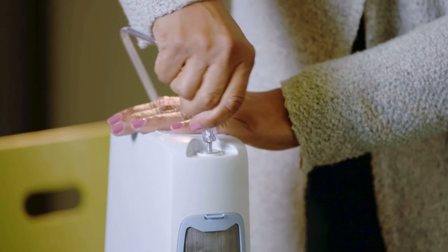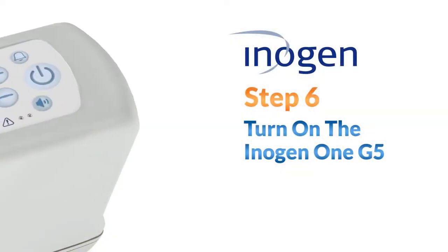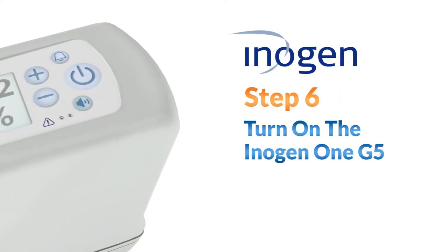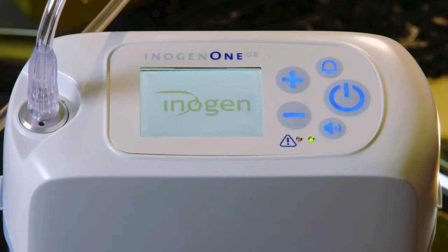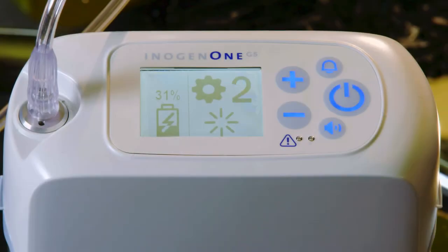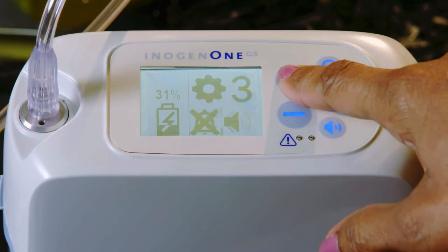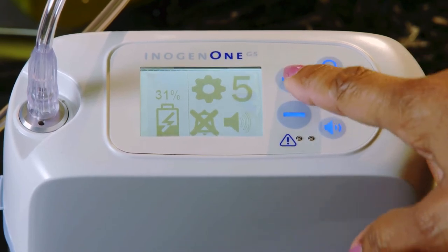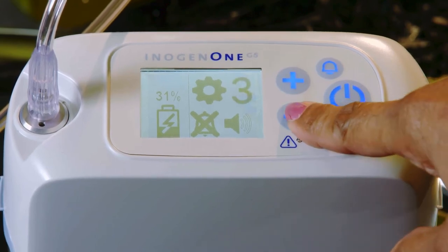Now you can connect the nasal cannula tubing into the metal nozzle on your Inogen 1 G5. Turn on the Inogen 1 G5 by pressing and holding the on-off power button until you hear a beep and/or see the display screen turn on. Set the flow settings to the flow rate prescribed by your clinical professional. The flow setting can be changed by pressing the flow setting buttons marked with plus and minus symbols. Be sure to select the flow setting prescribed by your physician.